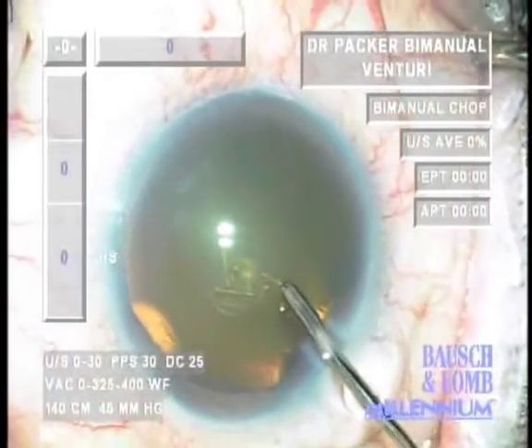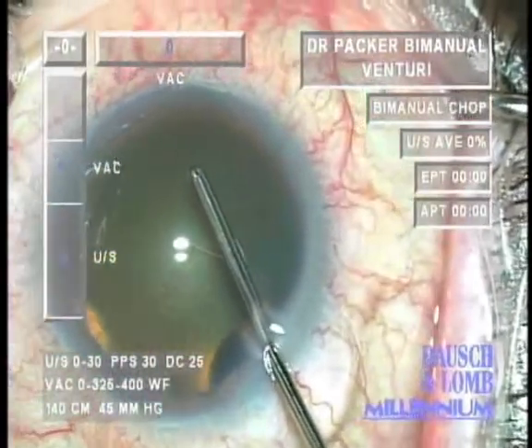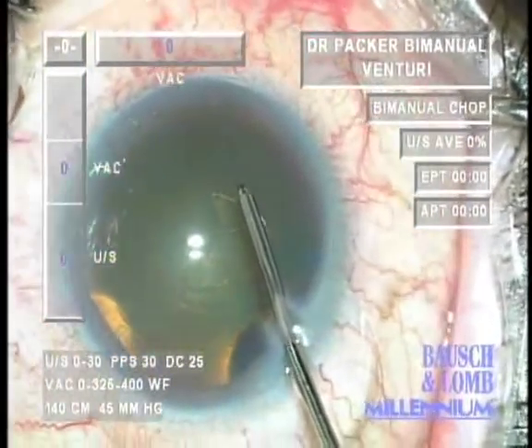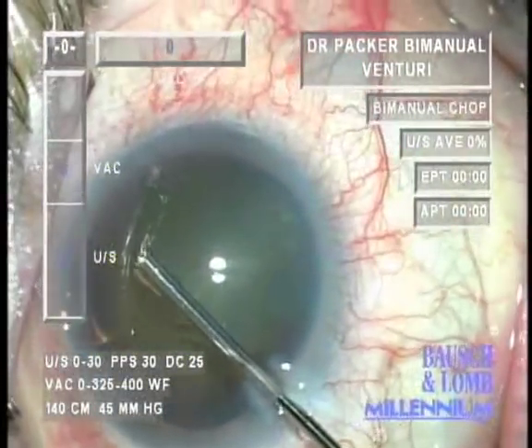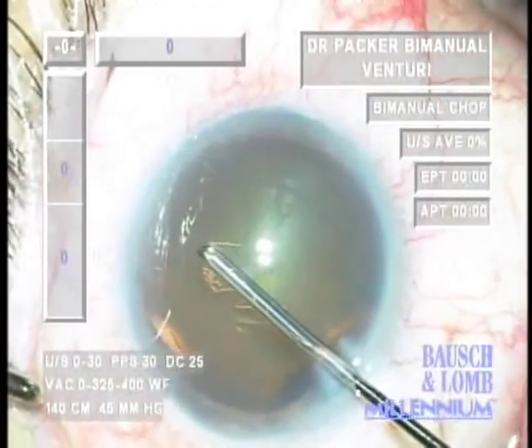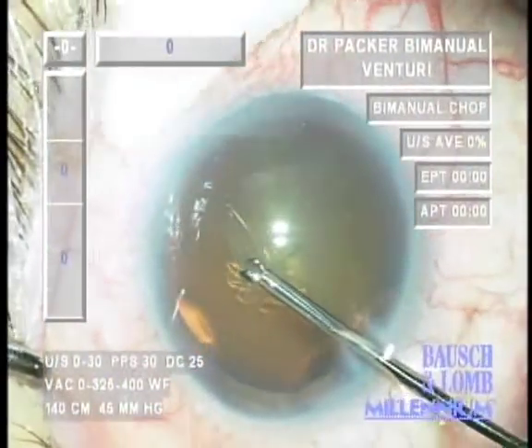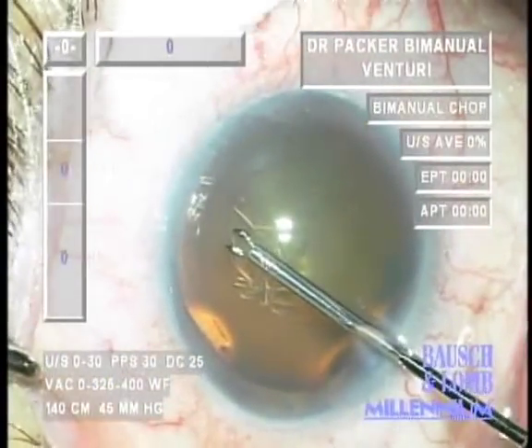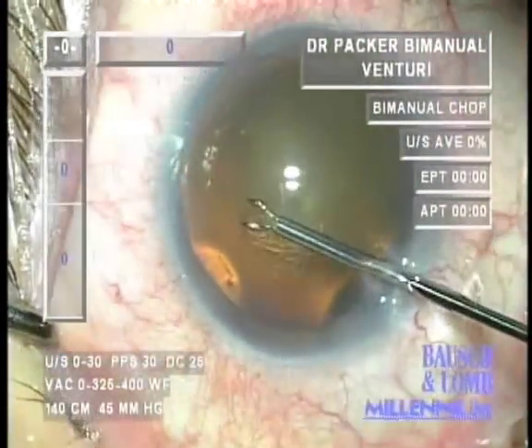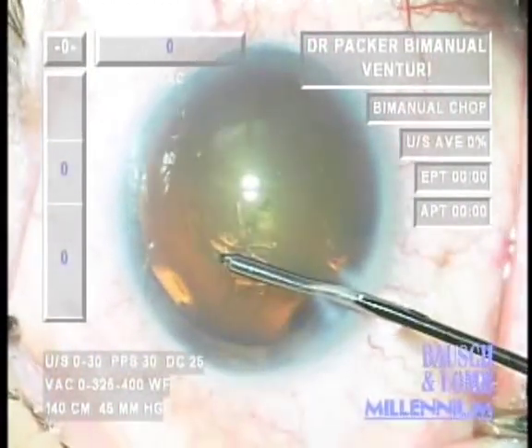One of the steps of surgery in which these microincisions add to control is the capsulorexis. Through a 2.5 or 3 millimeter clear corneal incision using Utrata forceps, it's very common for viscoelastic to burp out of the incision with subsequent shallowing of the anterior chamber and loss of control of the capsulorexis. With this sub-1 millimeter incision, minimal viscoelastic is able to egress during maneuvers and therefore the chamber remains absolutely steady. This allows custom design of the capsulorexis — whatever size chosen, perfectly round, without any loss of stability or control.